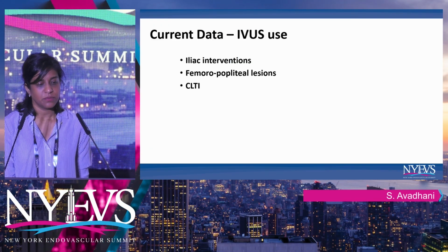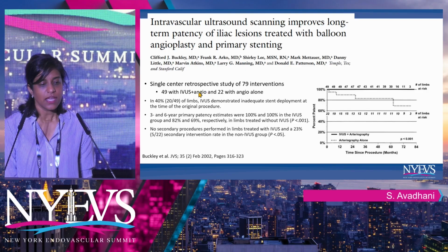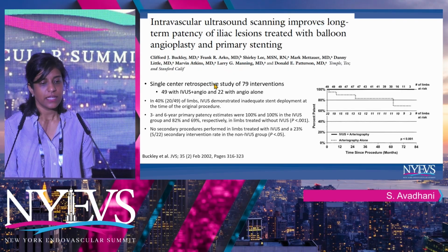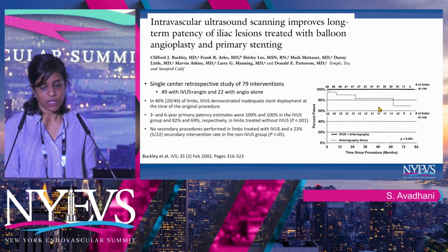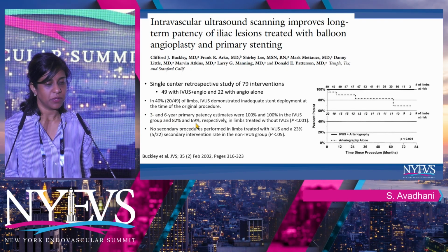I'm just going to go through some data with IVUS use in iliac, femoral popliteal, and CLTI interventions. This data is a little bit outdated, a single center retrospective study that looked at iliac interventions and compared the use of IVUS and angiography versus angiography alone, and looked at 3- and 6-year primary patency rates.